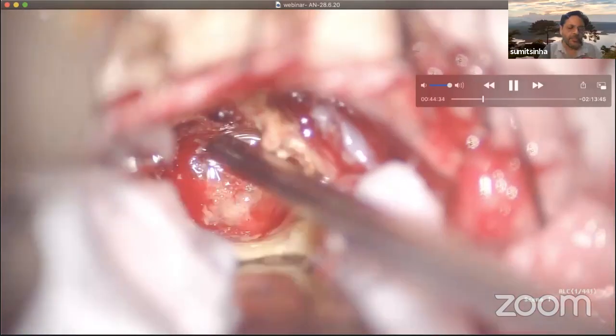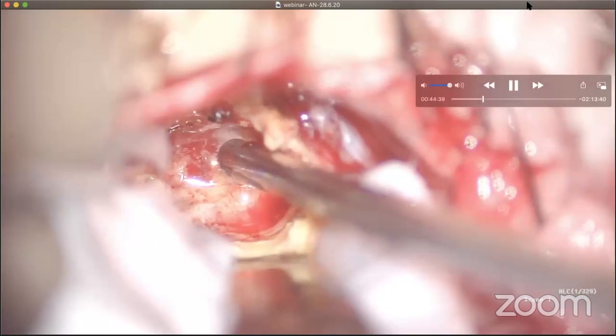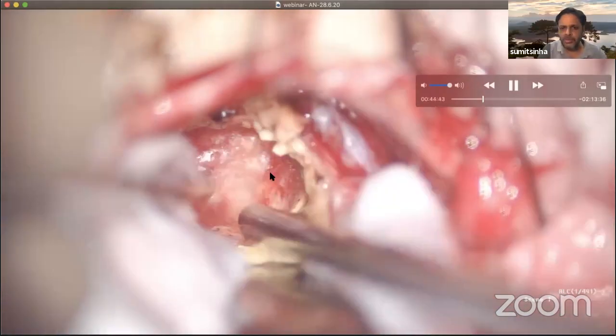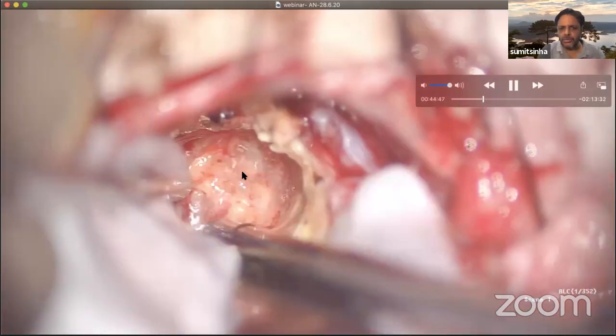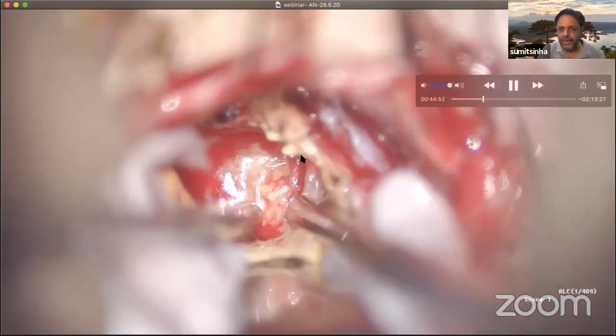Okay. So someone asked, what is your pattern for dissection? Yeah, I answered the question. My pattern is, I first of all do the central decoring, and then I prefer to go to the lower pole, which I'm doing right now.